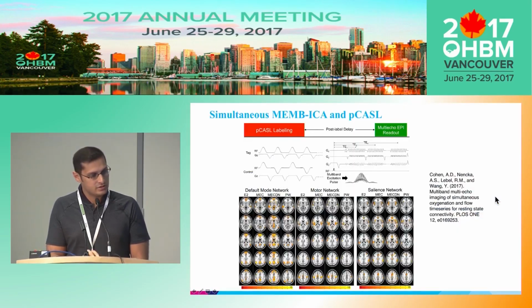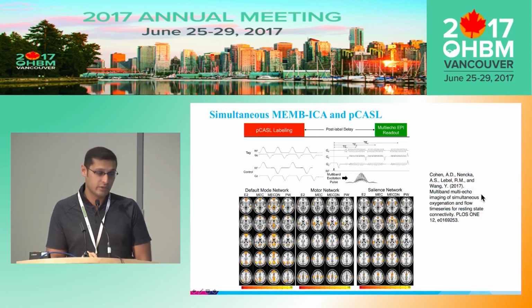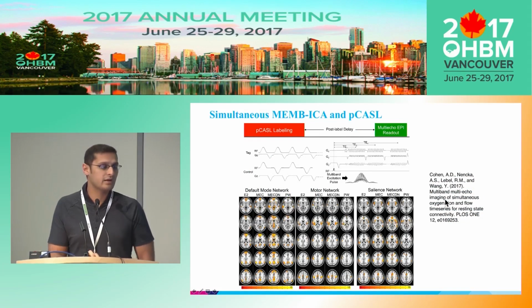So, future directions: Cohen et al., along with GE, have implemented simultaneous multi-echo multiband with PCASL.